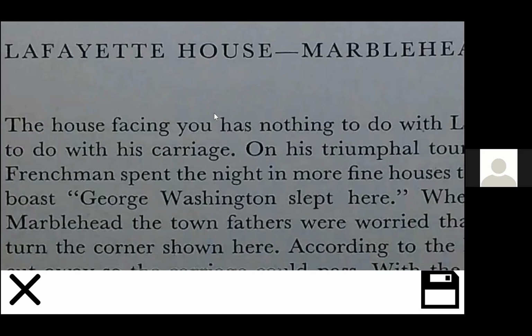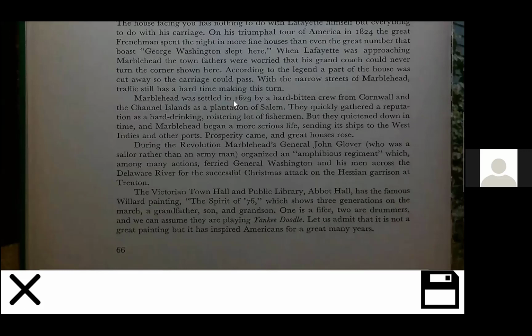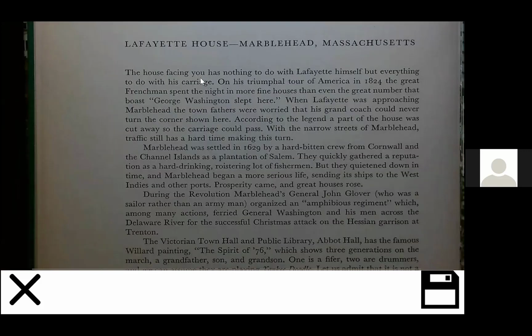So does that sound come over okay? Yeah, I heard it well. Awesome. So that'll then read it. You've got two options as well. So this is kind of the live mode where I'm allowing it to track, word for word. It's highlighting the word in the text the exact way that it's viewed. Or you have another option where it would just show you all of the text. And I can show you where you would change that setting afterwards too.